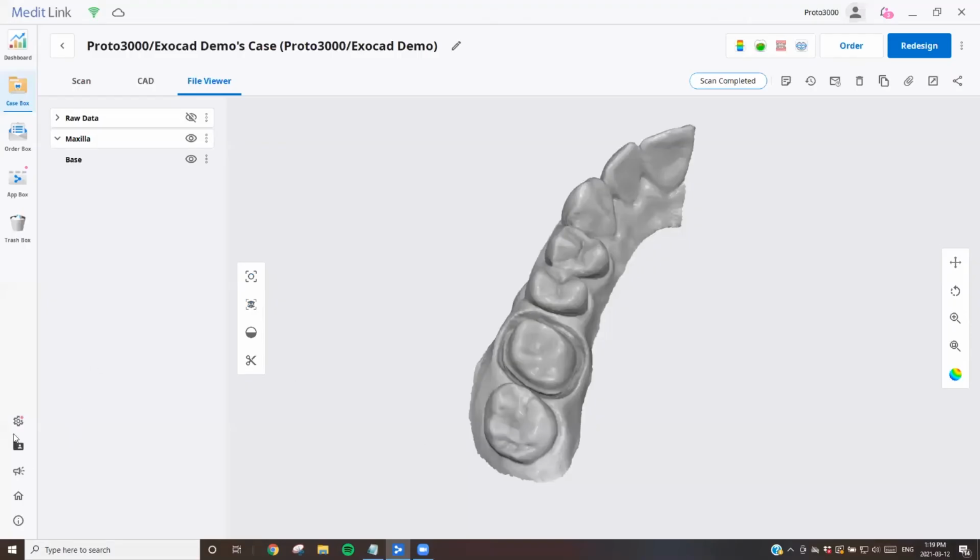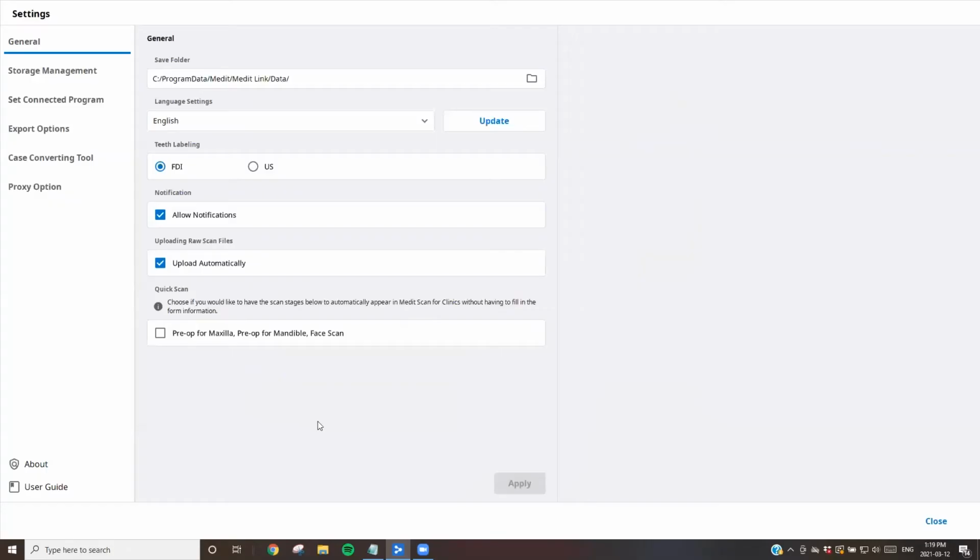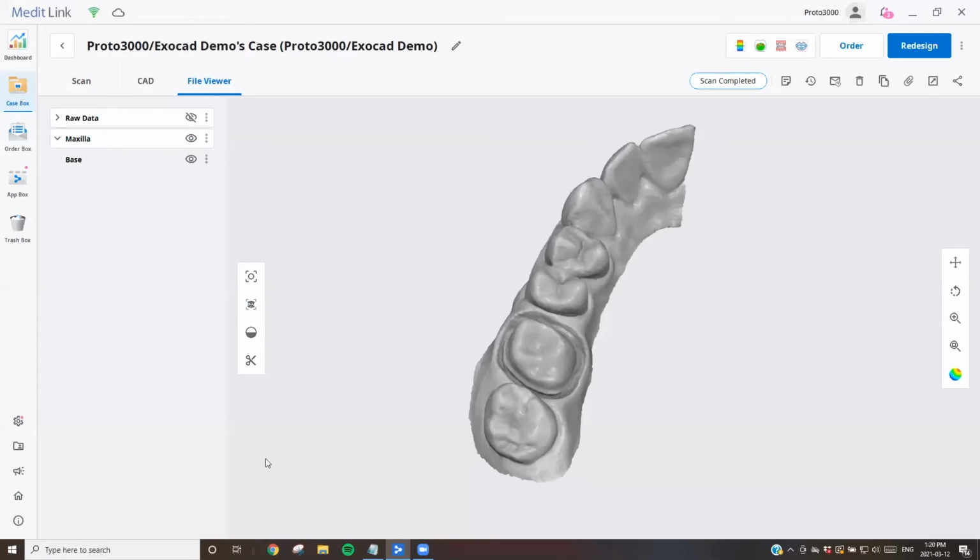And to that note, if you want to create a partnership, the ease of use for Medit is that there are two types of files to be had here. You have the clinical version of Medit and then you have the lab version of Medit. So a clinic would download the clinic version, the lab would receive their version, and you can create a partnership between the two by creating a digital handshake, so to speak.